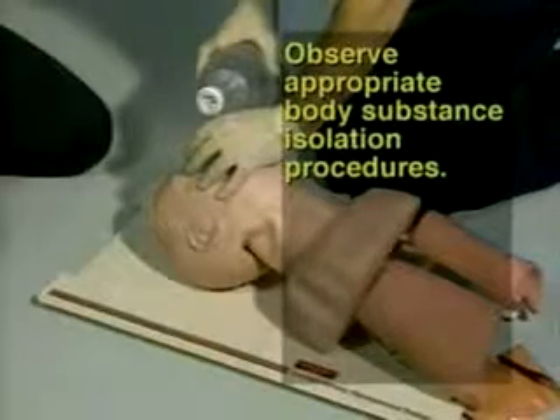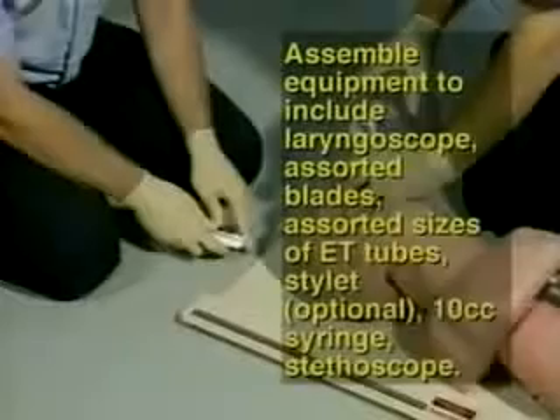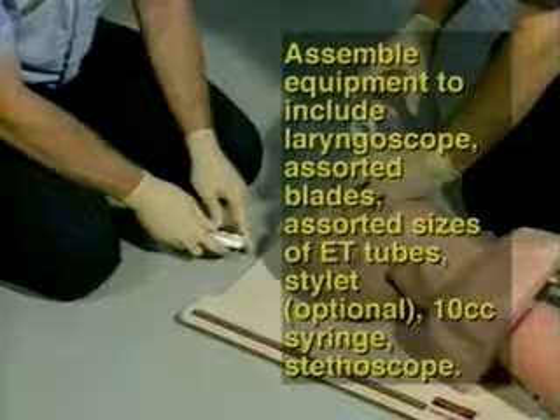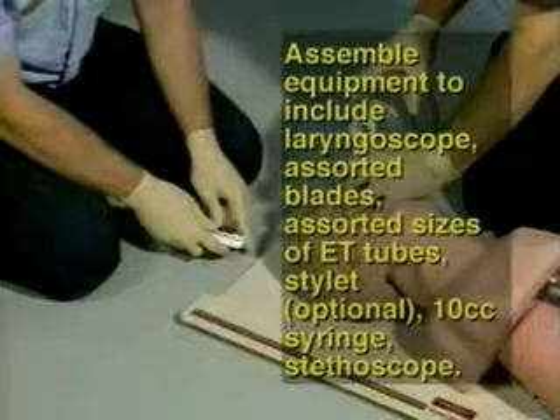The steps are as follows. Step 1: Observe appropriate body substance isolation procedures. Step 2: Assemble the equipment to include a laryngoscope, assorted blades, assorted sizes of ET tubes, a stylet (optional), a 10cc syringe, and a stethoscope.